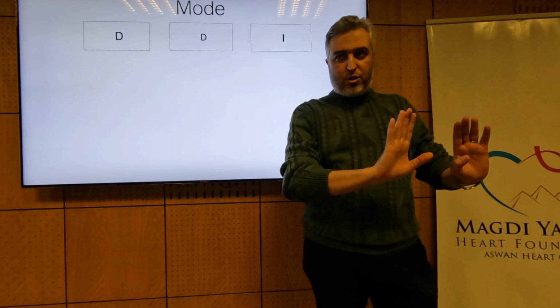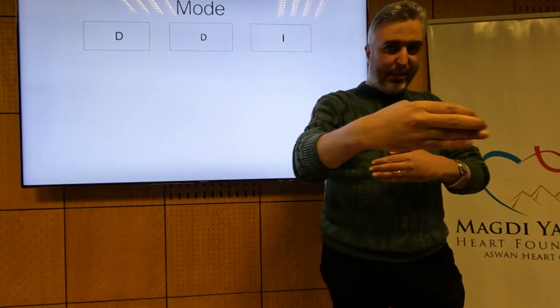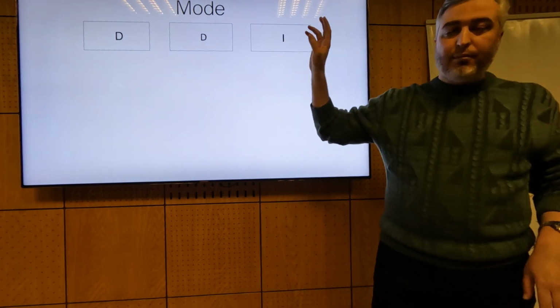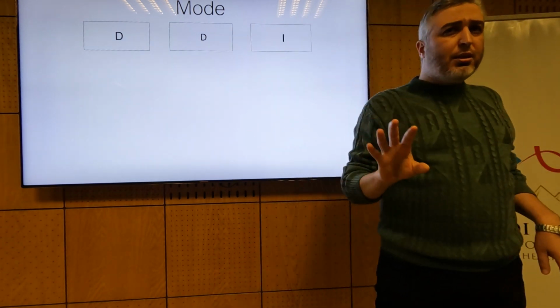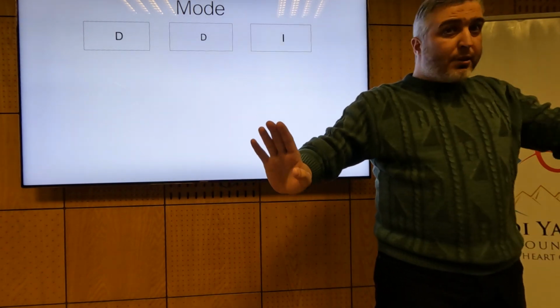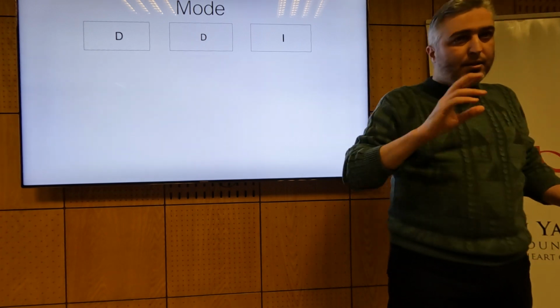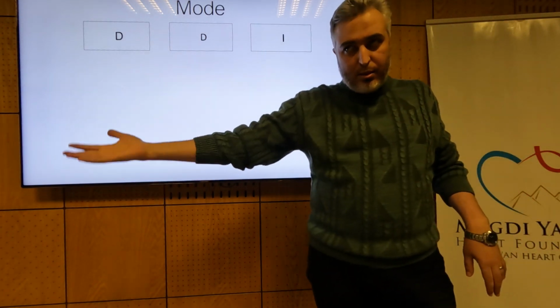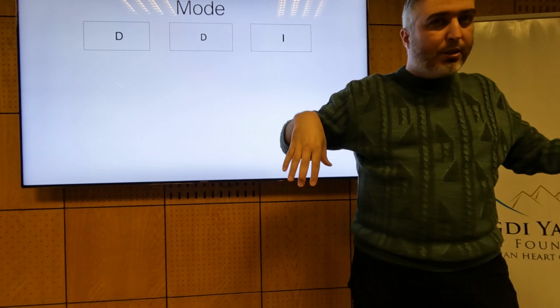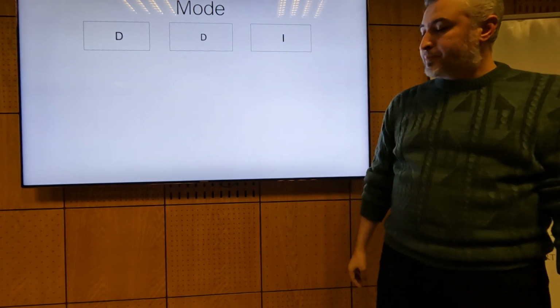What I'm going to say is not accurate, okay? This is not accurate, but it gets a lot easier to understand. This is as if you're putting your patient on an AAI and a separate VVI pacemaker. As if you're connecting the atrium to an AAI pacemaker and the ventricle to a VVI pacemaker. This is not accurate, but just to get it easier to understand.